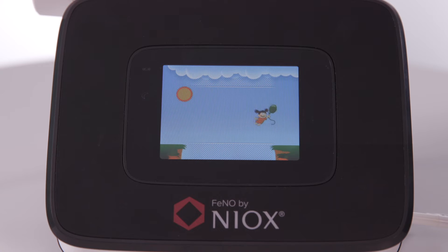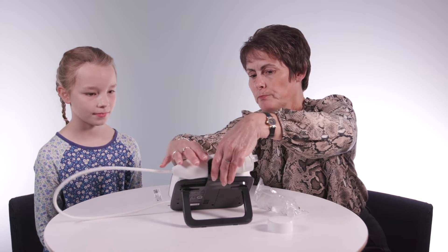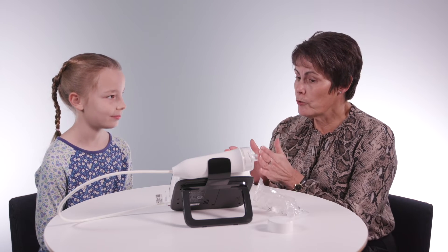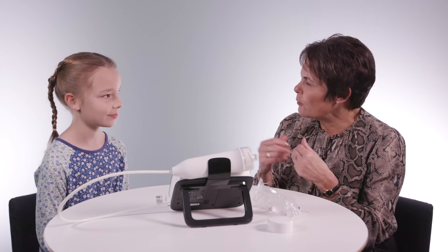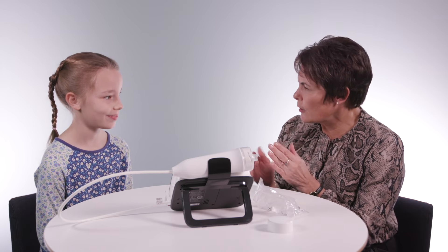That's absolutely fantastic. Well done, spot on. Keep going, keep going — and you've got to the end. Well done, that's absolutely lovely. Now we can see a countdown; that's going to take just over a minute, and then we're going to get a number on the screen. We'll look at the number and we'll decide what's actually going on in those breathing tubes, and it will help me decide whether or not you need to go on an inhaler or what sort of treatment, because we've got to try and give you some help and get rid of that cough.